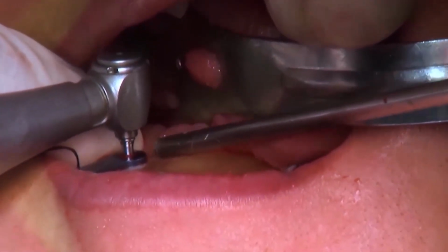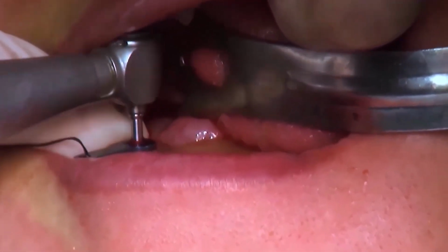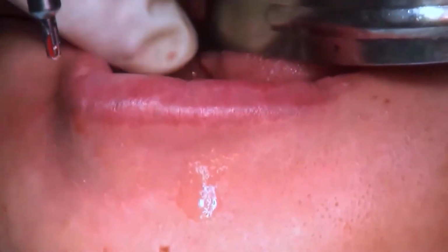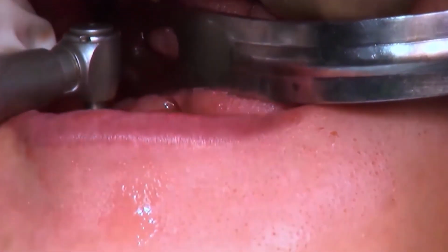The first drill is very important. If the drill axis is created inside the bone, it is very difficult to change or correct.